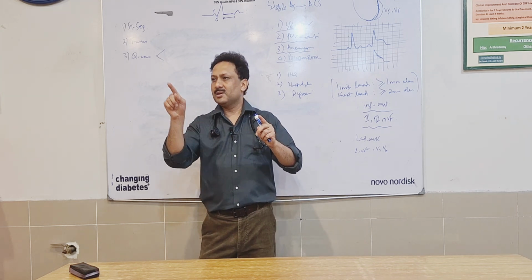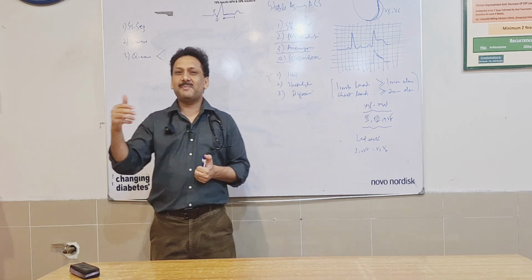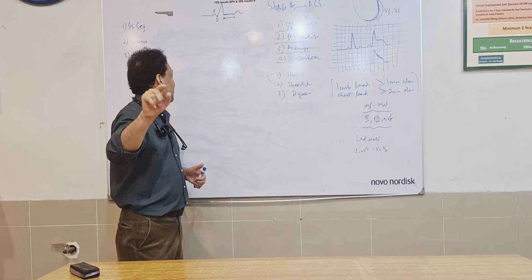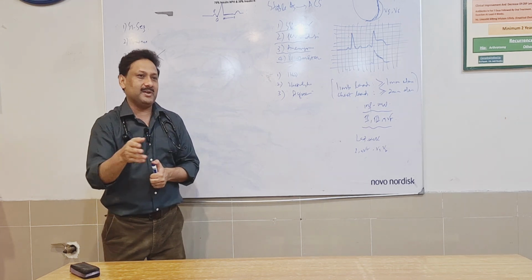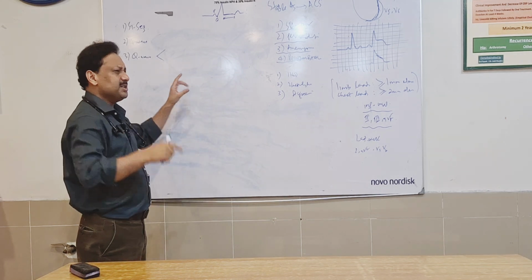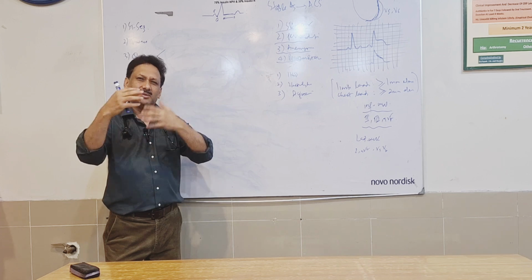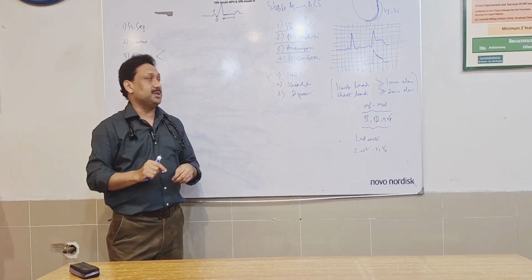In females, it is as per ECG that females are more deceptive than males. So it's as per ECG. It's not what I'm telling you. V1, V2, V3 can be deceptive in females, but not in males, right? It is probably because of the breast tissue shadow. The things are not very well formed, and their positioning changes a little.